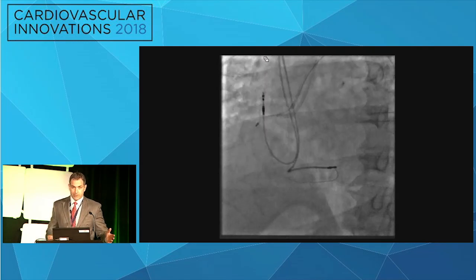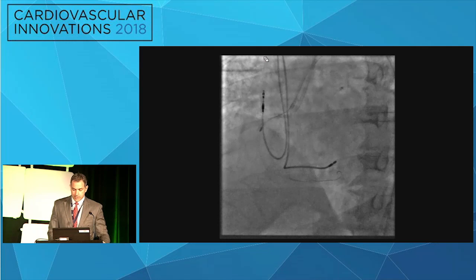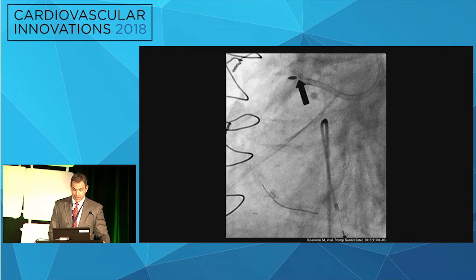So what we did do, and we didn't document this, of course, is we put our big boy pants on, and we took that guide catheter, and this is from another case report, and we deep-seated it just proximal to the burr, and I will tell you, we pulled with force. And this is not something you should attempt right off the bat. You can perforate, you can tear the artery, it can be catastrophic.